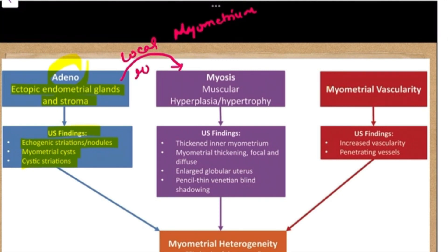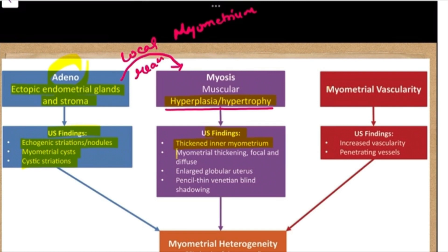Because of these ectopic endometrial glands within the myometrium, they incite a local reaction causing the muscles to undergo hyperplasia or hypertrophy. Due to this muscular hypertrophy or hyperplasia, we have ultrasound findings like thickened inner myometrium, myometrial thickening that can be focal or diffuse, an enlarged globular uterus, and pencil-thin venetian blind shadowing. On color Doppler, vascularity is increased with tortuous penetrating vessels traversing through the adenomyosis lesion.